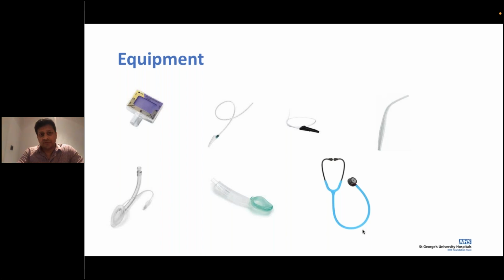Further equipment to keep in focus is your EtCO2. It's your end-tidal CO2 marker, which is one of the ways of making sure that the endotracheal tube is in a good position. I've put in a picture of one of these, but at St. George's we have a slightly different one, which looks different. And we know now with NLS, though this session is not NLS training, that the Guedel airway has been replaced by the LMA.